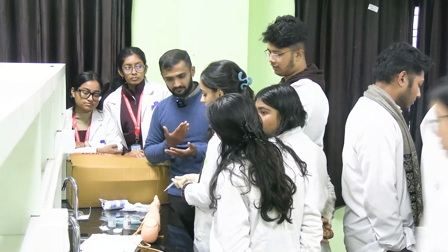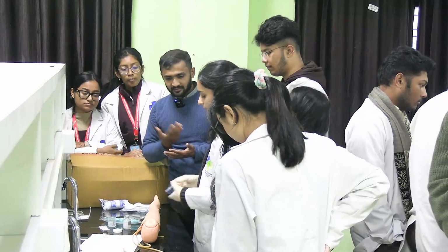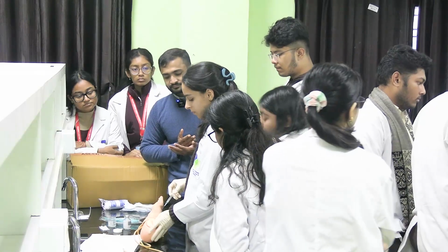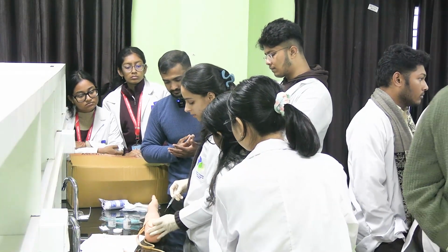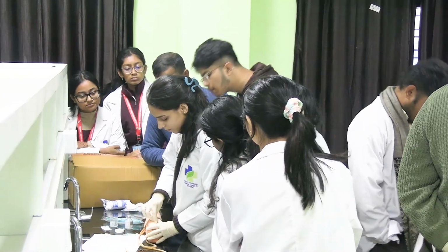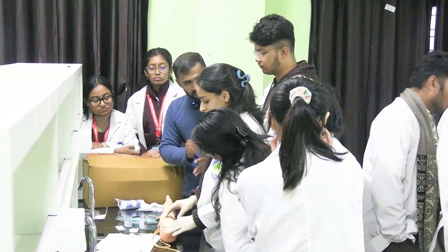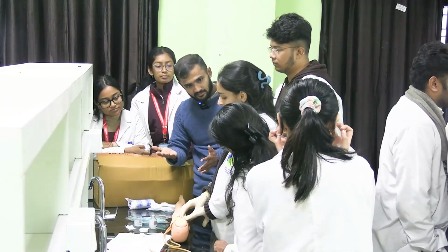If yes, then locate the site. For SC, suppose you are taking the lateral aspect of the arm. Then after locating the site, you have to clean the area. Before cleaning it, you have to hand wash, wear the gloves, clean the area. How many times? 3 times. Then air dry.